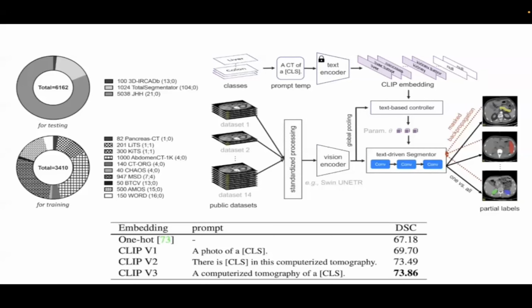The default learning rate for these implementations is 4e-4 with a momentum of 0.9 and a decay of 1e-5 on multiple GPUs. The framework is implemented on MONAI 0.9.0.